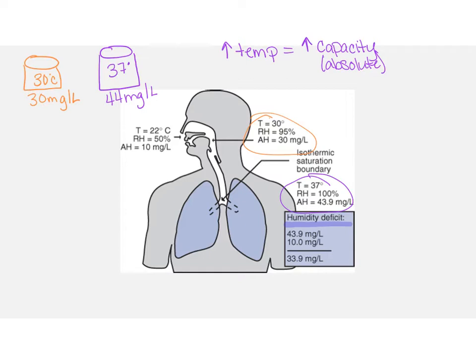There's going to be too much water vapor in the gas. So overhumidification and heat, and this is artificial, so this is what we add. If we are overhumidifying our patient or adding too much heat, or overcompensating for their needs, this is something we do.